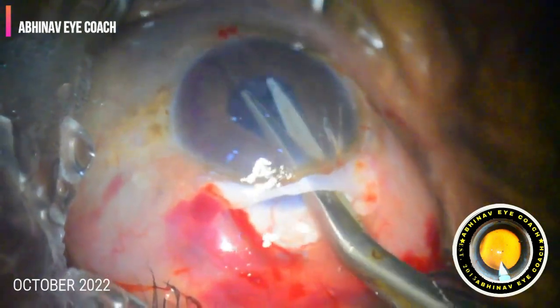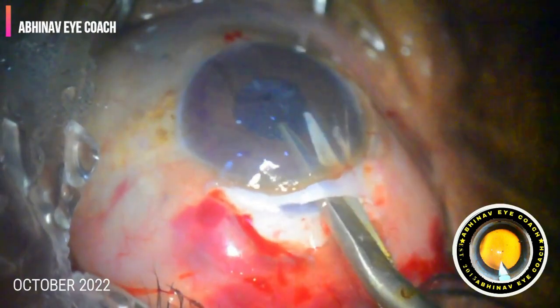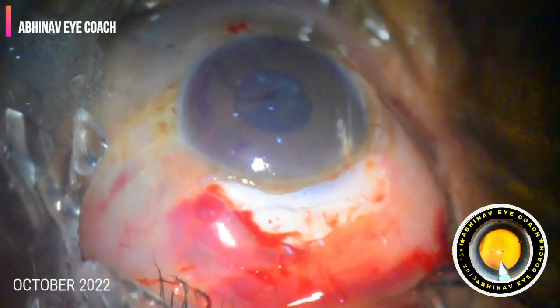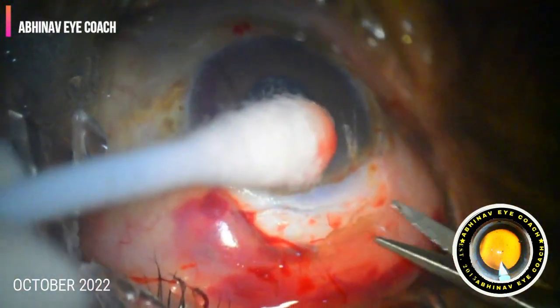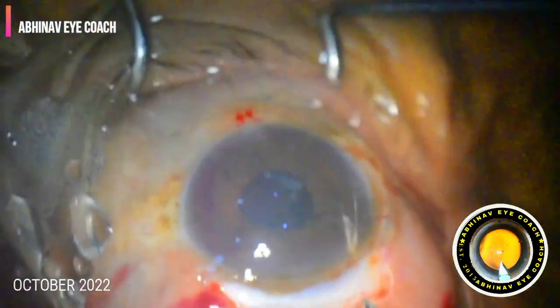Preservative-free triamcinolone acetonide was introduced into the eye to stain the vitreous. I am doing manual vitrectomy, and we have cleared the vitreous from the anterior chamber, including all vitreous tags.